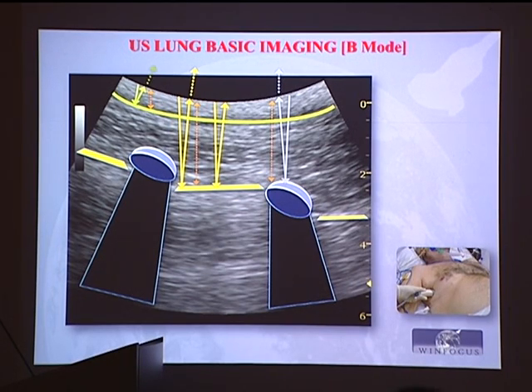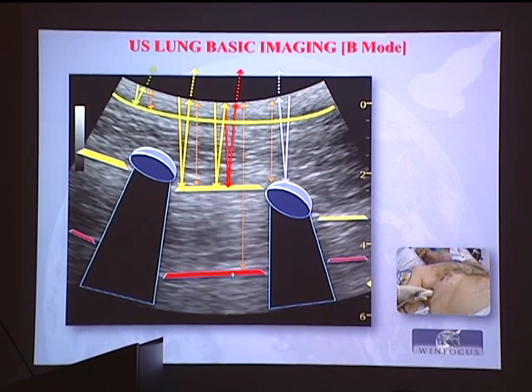What else? Some of the waves are not just reflecting once, but they are being reflected by the skin and then again by the pleural line before coming back to the machine. So the machine will have signals coming delayed by double the time. You see, 1, 2, and they are coming back. So the machine will represent dots and lines deeper than the pleural line, but not coming from a structure that is reflecting, just because there is a reverberating effect that is creating a mirror.